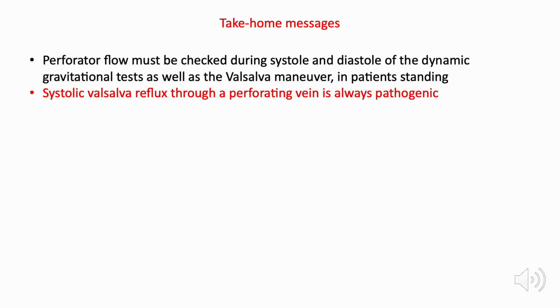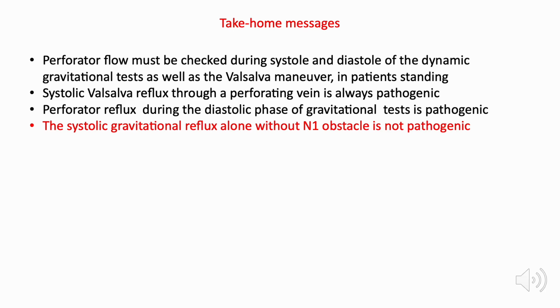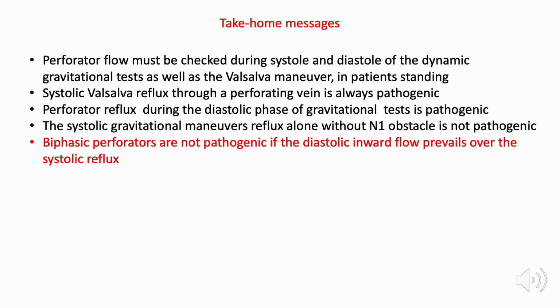Systolic Valsalva reflux is always pathogenic. Perforator's reflux during the diastolic phase of the gravitational test is pathogenic. The systolic gravitational reflux alone, without N1 obstacle, is not pathogenic. Biphasic perforators are not pathogenic if the diastolic inward flow prevails over the systolic reflux.